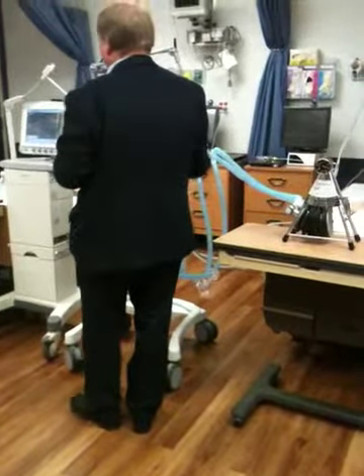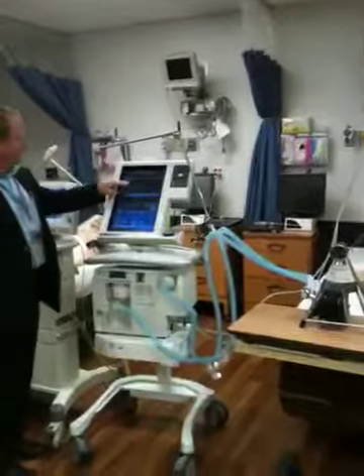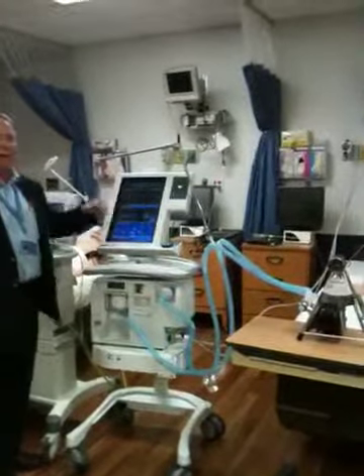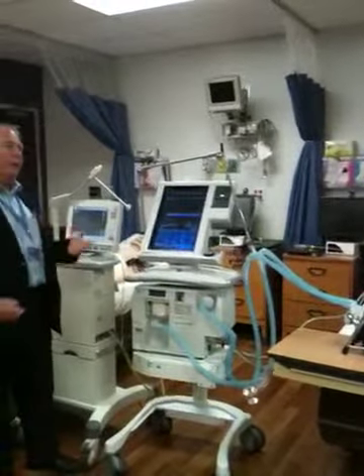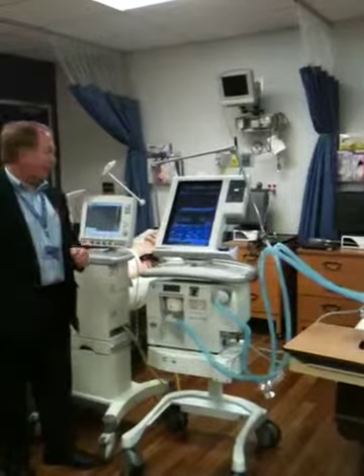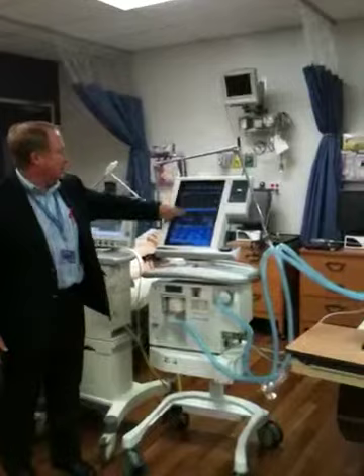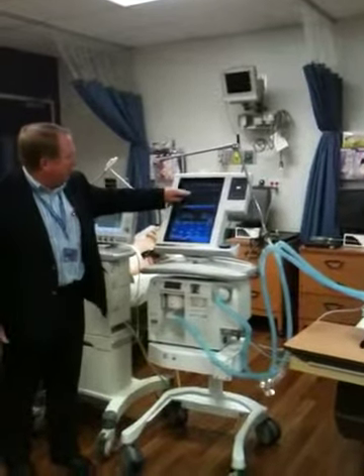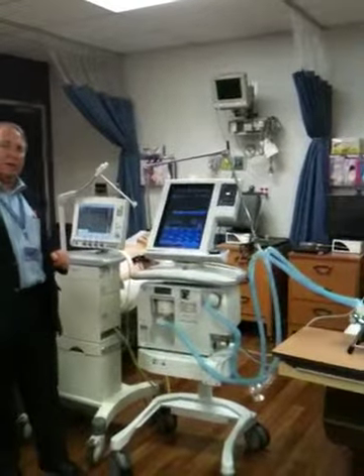I can plot any of those, the data. This one is using flow volume. Flow is here, volume is this way. That's how we do our pulmonary function studies. It's a flow volume loop. We're comparing flow versus how much of their volume they exhale. They should get most of it out at the very beginning and gradually slow down. In this case, it's showing me mine is bellowing in on the inside here. It's got more resistance than it should.